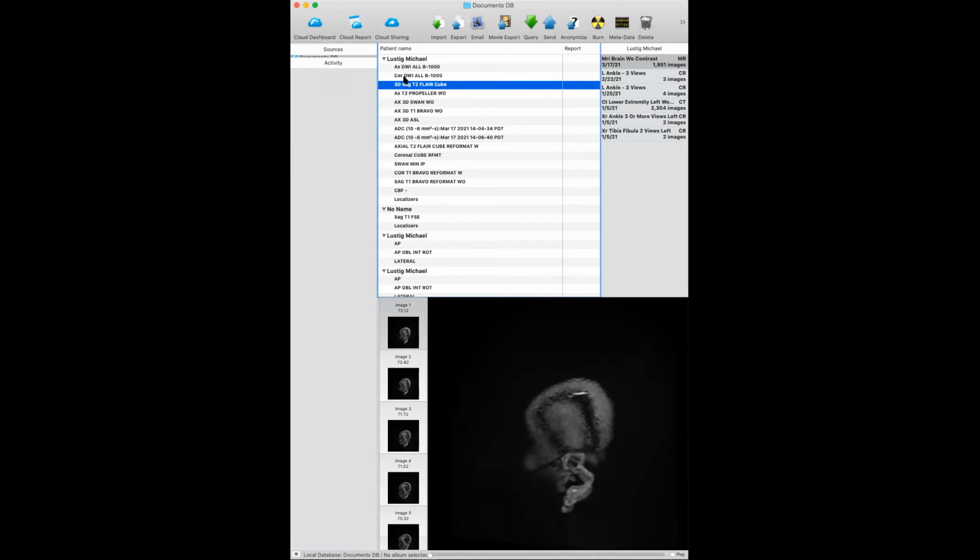There's also, again, 3D, T2 weighted, but fluid suppressed. So fluid attenuated inversion recovery. It's called FLAIR. And I mentioned to you why we want to do this. So you do an inversion pulse, you wait till water crosses 0, and then you do imaging. And this is a 3D sequence that uses spin echo for that.